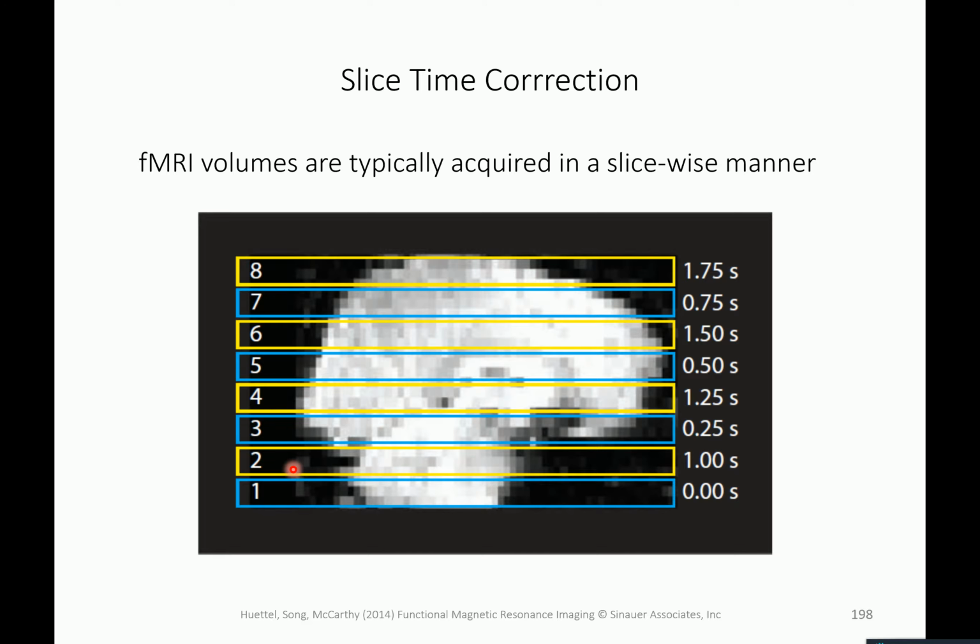So if you would do it immediately here, this would be a little bit pre-excited and maybe then already, in terms of signal decay, decayed more. So instead of exciting the second spatial slice directly adjacent to your first slice, you leave something out. However, that's also not completely true.